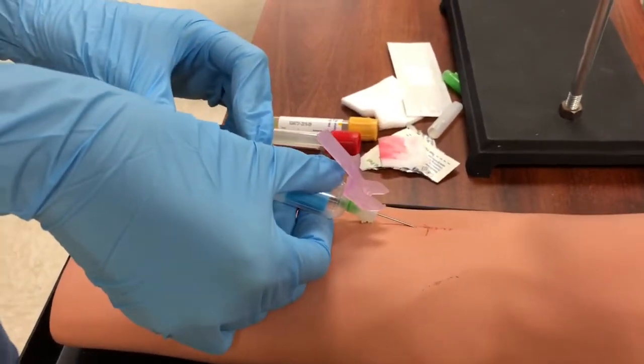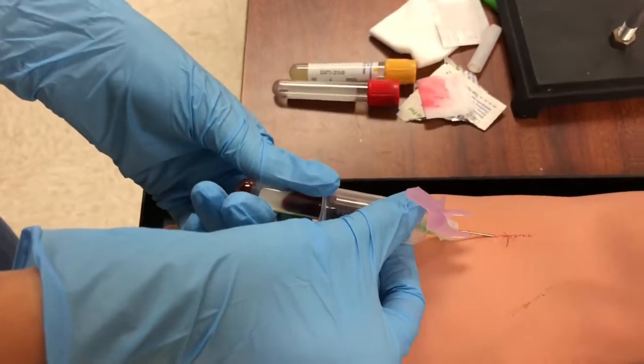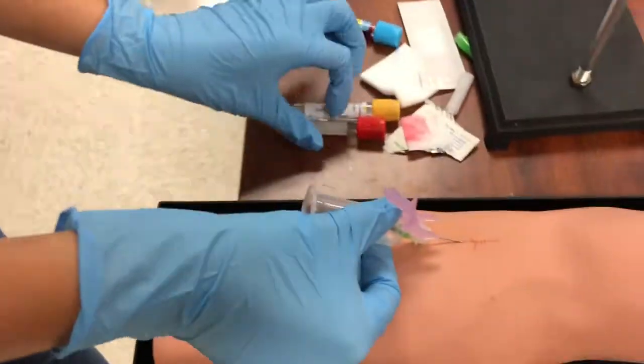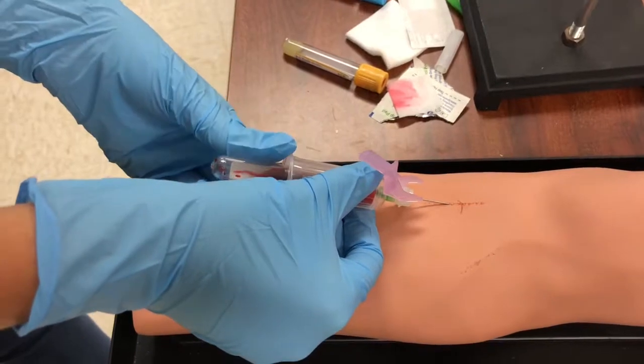I start inserting my vacutainer tubes and collecting blood. I make sure to keep the needle still so I'm not moving in and out of the patient's arm during the venipuncture. I continue to do this with the rest of the vacutainer tubes, making sure to keep the needle steady.